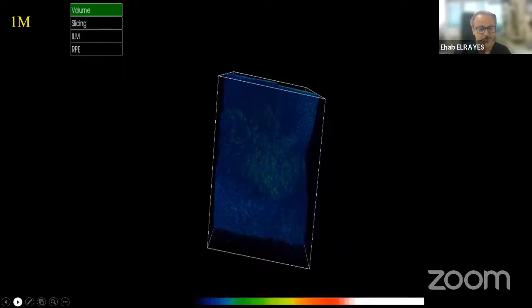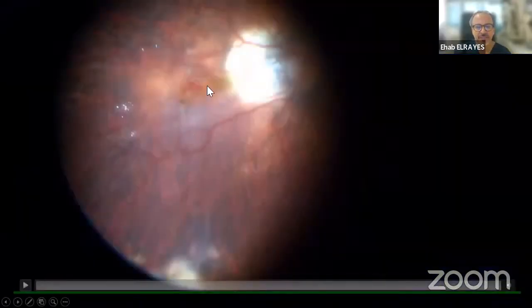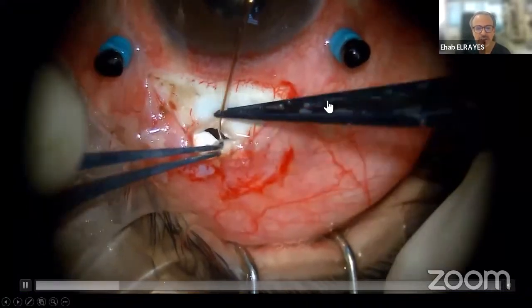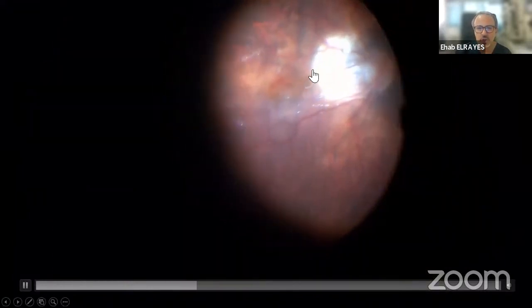that you need. Now, in real life cases, this is a patient that had failed macular hole surgery twice, a myopic patient in a staphyloma, and you can see the fluid is trapped in there in the staphyloma, and the edge is elliptical because we removed the ILM several times before, failed, and the fluid stays trapped inside. So in this patient, we got the catheter inside the eye again, and you can guide it according to where the location is. And right underneath where the hole is, you start to inject.